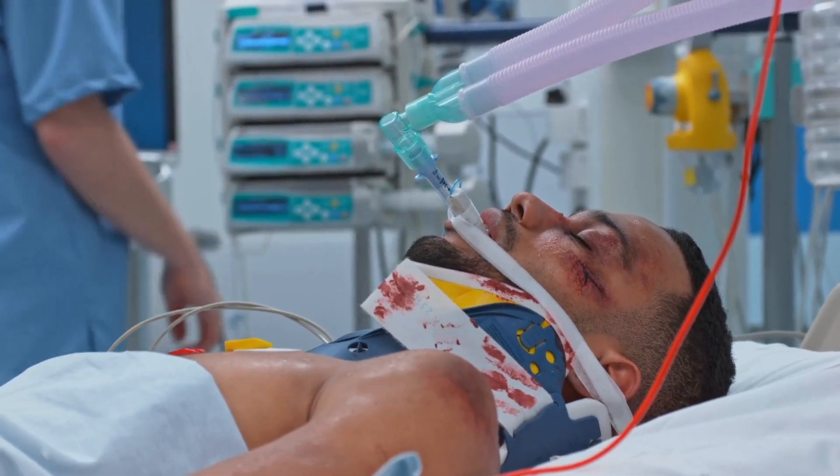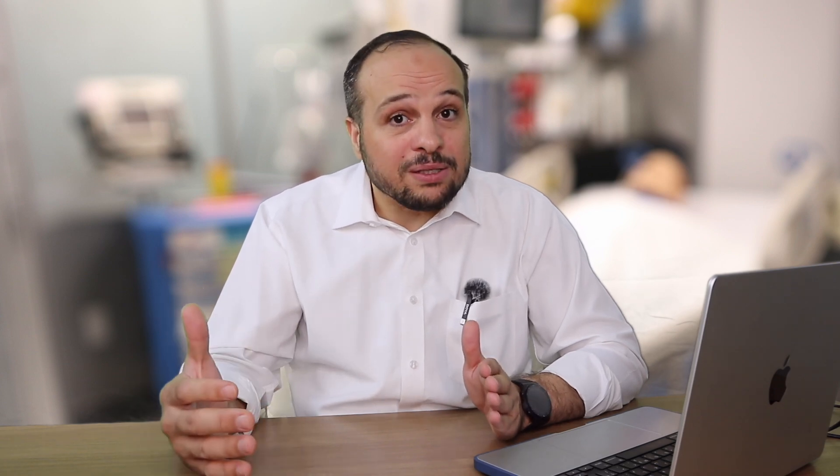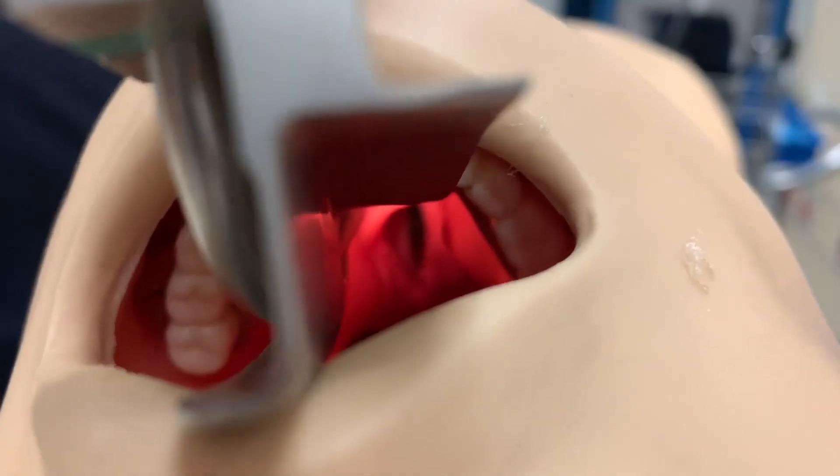In certain cases, some people cannot breathe on their own due to different reasons — maybe a tumor, loss of consciousness, during surgery, or neuromuscular diseases. As a result, that person cannot breathe by themselves. In that case, they will intubate — they will insert an endotracheal tube.